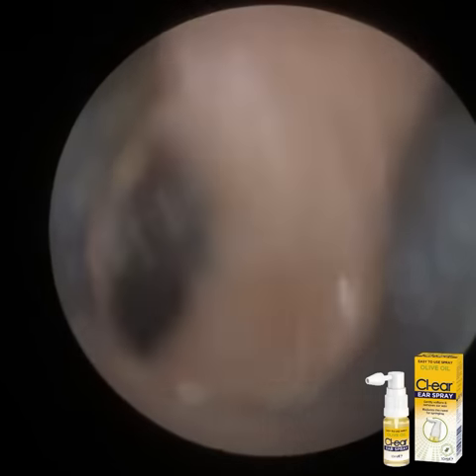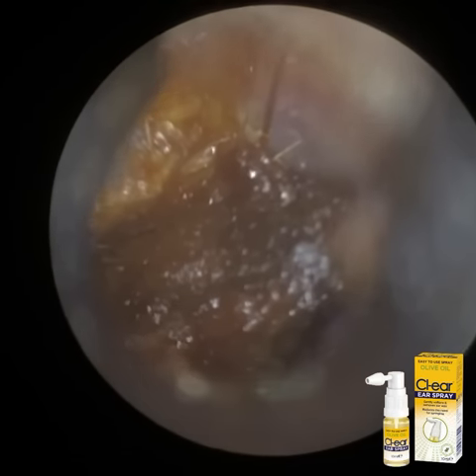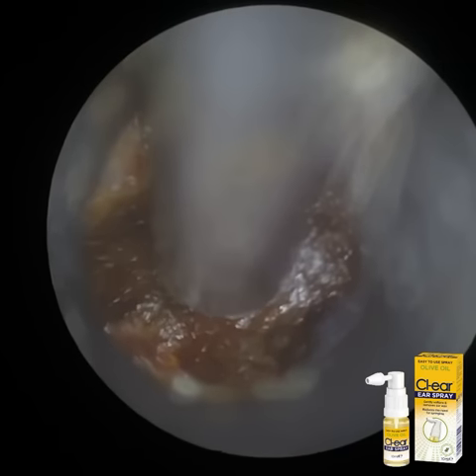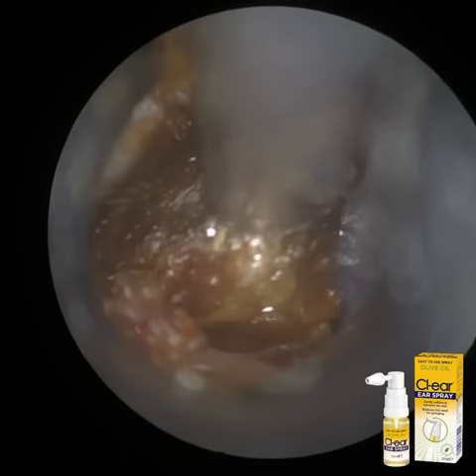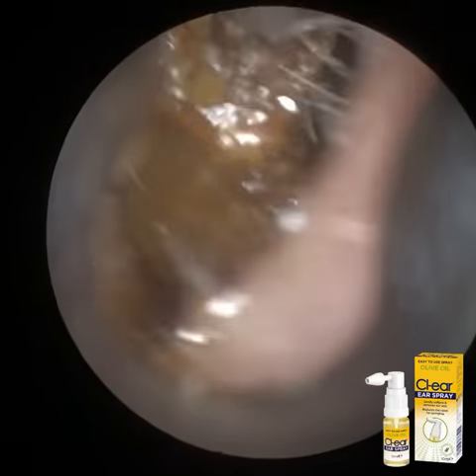So we've got this remaining bit of wax and skin directly on the eardrum. We're just going to adjust the focus and we're going to remove this. This wax plug is also attached and stuck in the inferior recess. So I'm going to go up and you can see there's a little trench there at the base of the ear canal. It's just pulled it out of that and away from the ear.